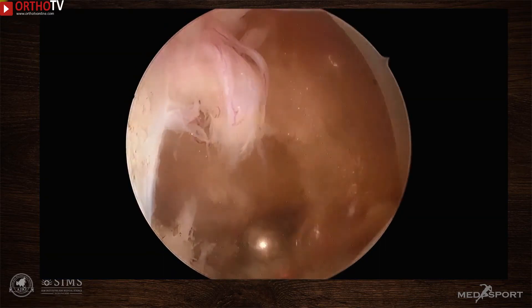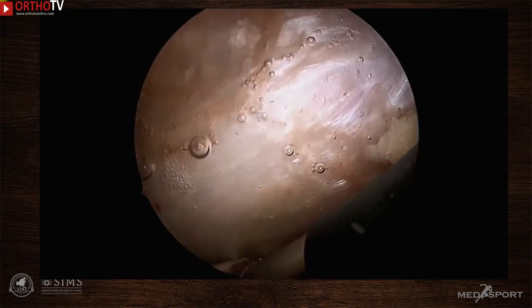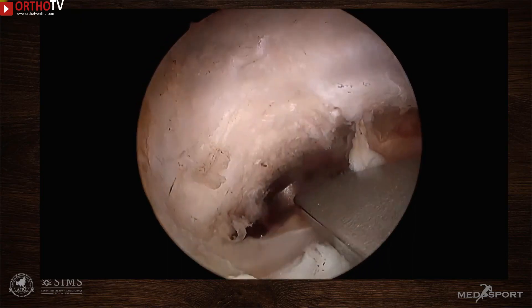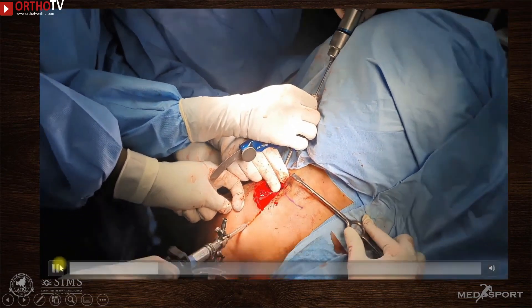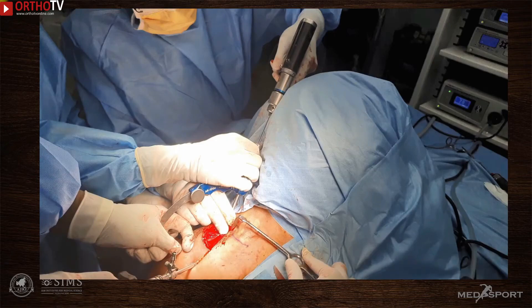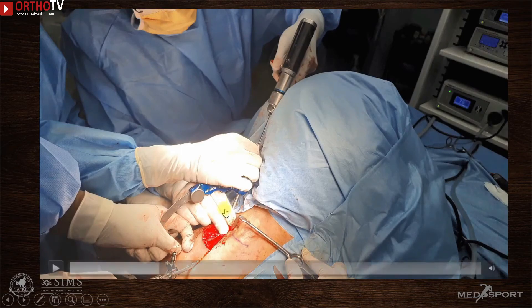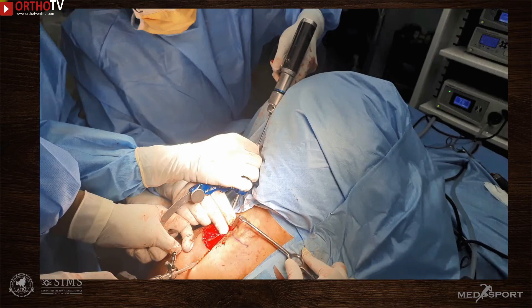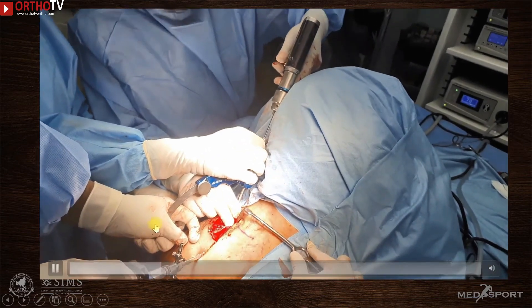In the arthroscopic view, the rotator interval is cleared using diathermy and the undersurface of the coracoid is exposed. The scope is then shifted to the anterolateral viewing portal and the aiming device for coracoclavicular drilling is placed. Before drilling, a unicortical drill hole is made on the superior surface of the clavicle approximately 25 mm from its lateral end. This unicortical hole provides a resting and holding point for the jig bullet, giving stability during coracoclavicular drilling. The transacromial K-wire also adds stability, as it would otherwise be very difficult to drill through a floating clavicle.